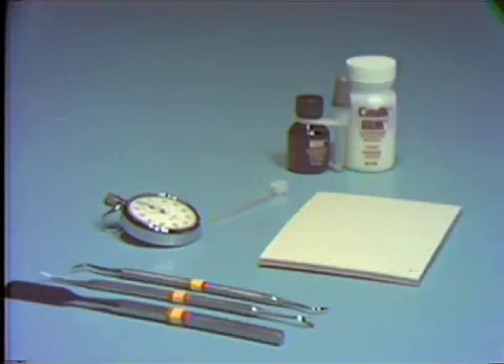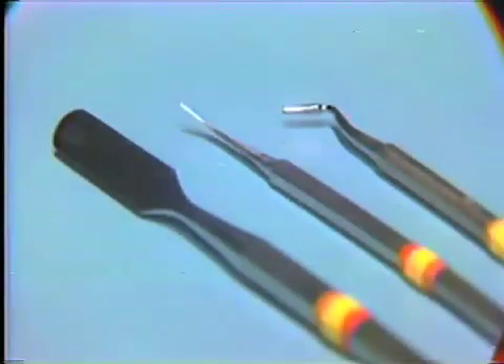A large mixing spatula — the number 336 spatula, or SP9 — is used to mix the material.